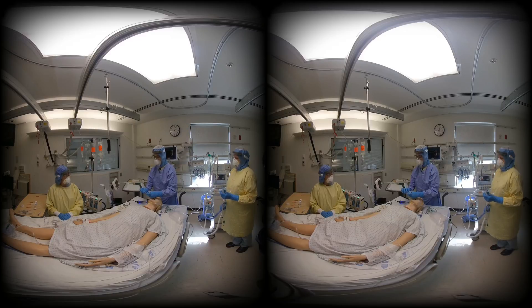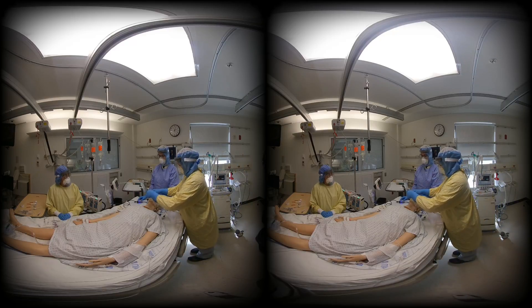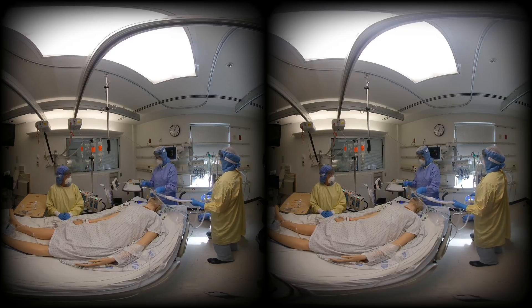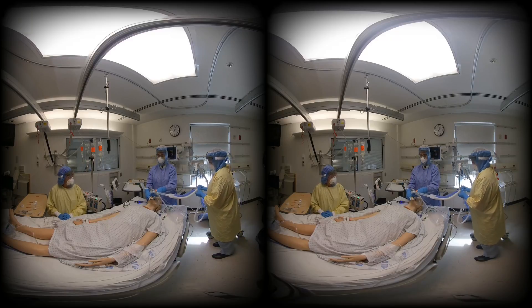The intubator will wait the full 60 seconds after paralytic administration to ensure complete neuromuscular blockade, then secure the airway under video guidance. Once inserted to the appropriate depth, endotracheal tube placement can be confirmed with a combination of end-tidal CO2, chest X-ray, and/or point-of-care ultrasound. Once successfully intubated, the cuff will be inflated by the intubator, and the circuit will be checked prior to initializing ventilation.